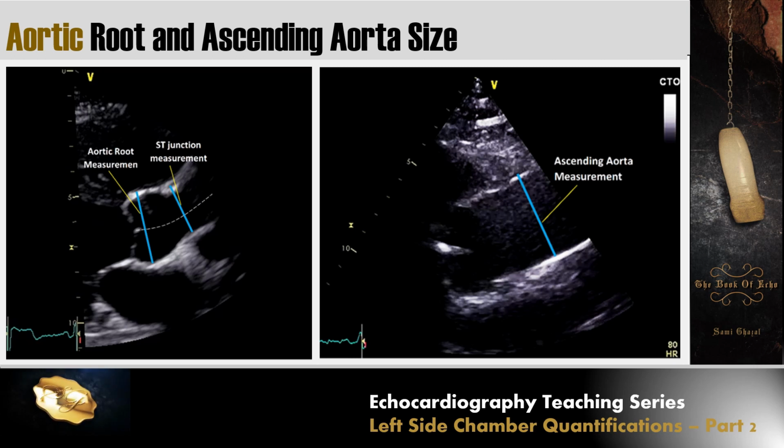Now, to complete the left side chamber quantification, we proceed now to measurement of the aortic root and ascending aorta. So what is the aortic root? So these are the aortic leaflets here, and aortic leaflets usually insert here. This is the insertion in the aorta, and usually they go in the wall all the way here to something called the ST junction, the sinotubular junction.